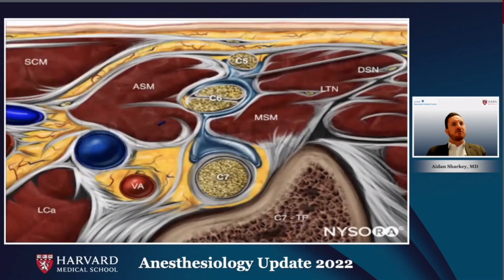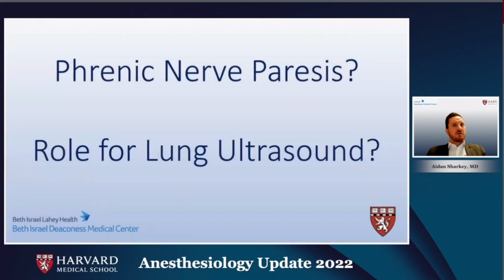Thinking about the intervention this patient underwent, that is the interscalene block, we must remember that this block often takes out the phrenic nerve, resulting in hemidiaphragm paresis. And in a tenuous patient such as our patient here, this could result in acute decompensation. So that leads to my next question, in that does ultrasound have a role to play in assessing the diaphragm for phrenic nerve paresis?